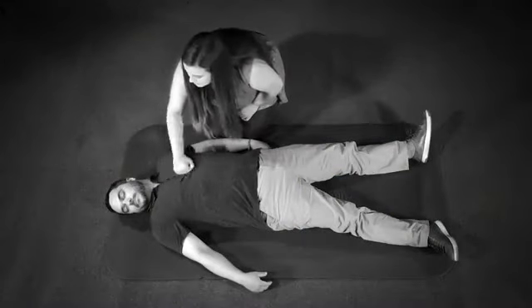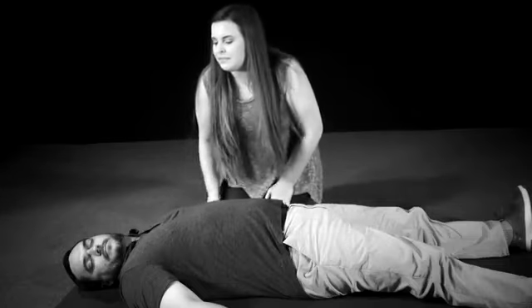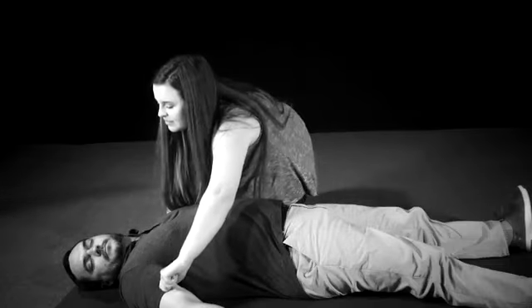If you suspect an overdose, check responsiveness. You can do this in several ways: by rubbing their sternum in the upper chest area, by yelling at them, or pinching them. If there's no response, you should administer naloxone immediately. Make sure that you've studied the instructions in your naloxone rescue kit.